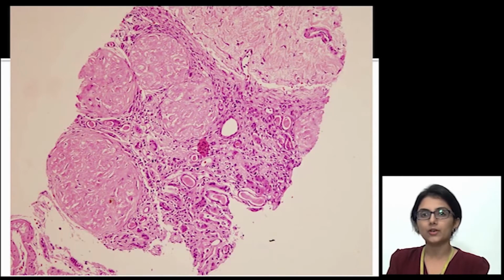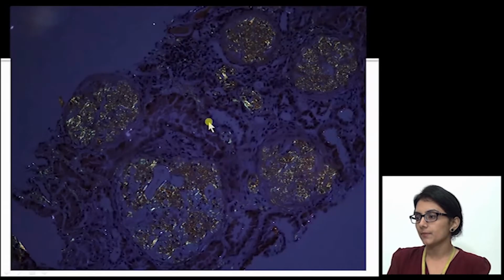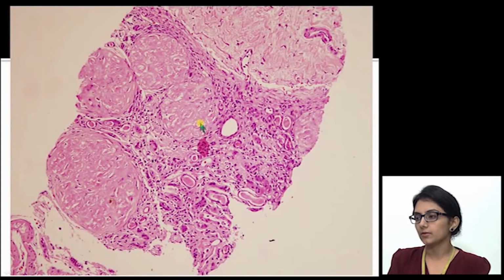So here for you, we've got a renal biopsy from a patient. He's a 45-year-old male presented with nephrotic syndrome. And as is clear from the biopsy, you can see that the predominant involvement is really in the glomeruli. They're replaced by abundant eosinophilic material, which displayed beautiful apple green birefringence under polarized light in a Congo red stain section. So we have our diagnosis.